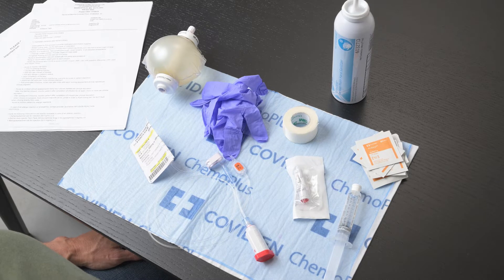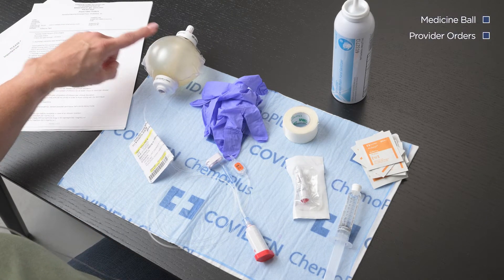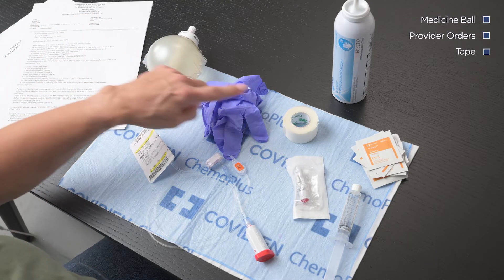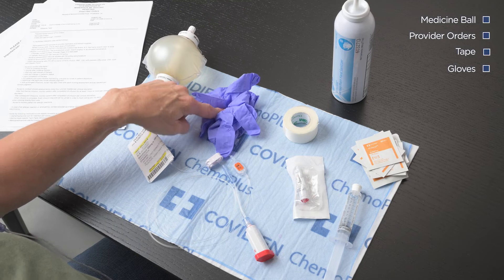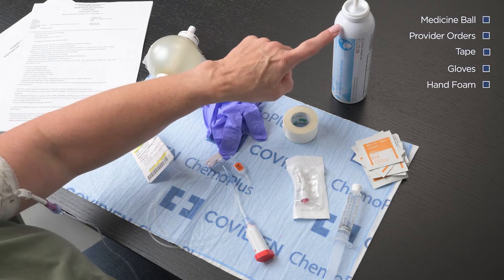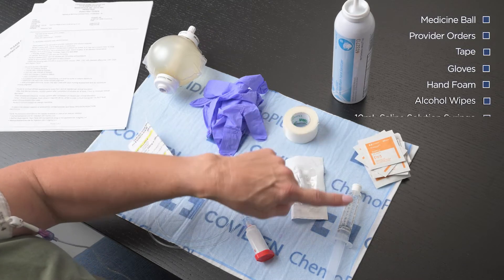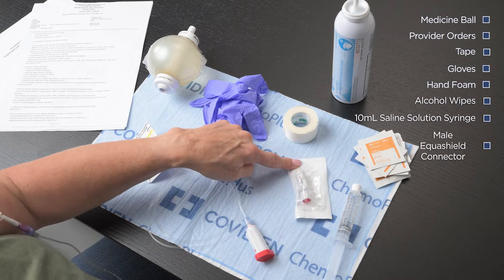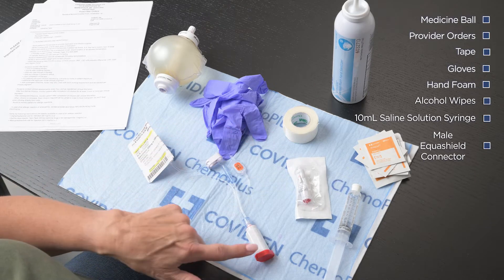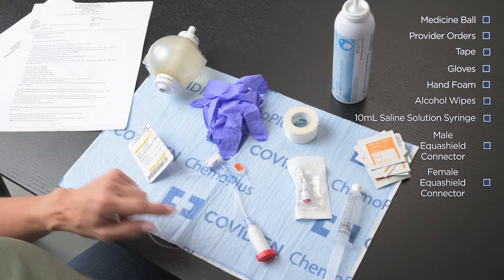Begin by gathering your supplies. For this process you will need your medicine ball, the provider orders, tape, gloves, hand foam, alcohol wipes, a 10-milliliter saline solution syringe, male Equishield connector, and a female Equishield connector which is already attached to the medicine ball.